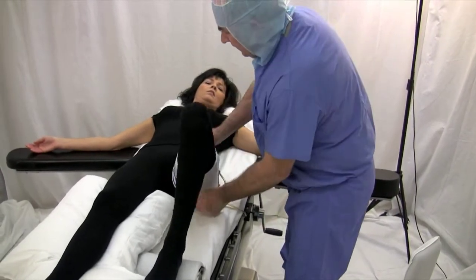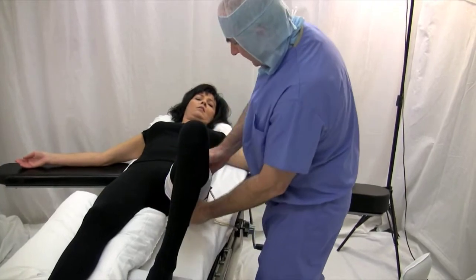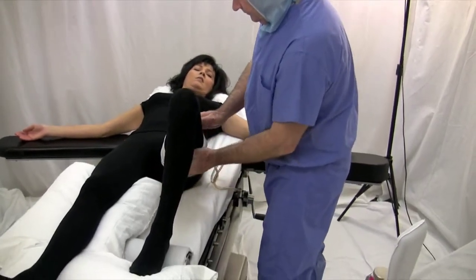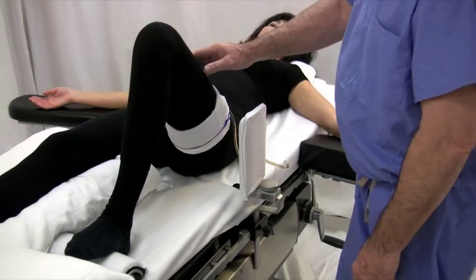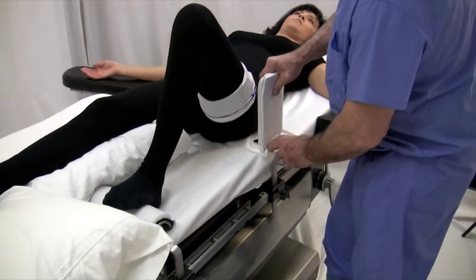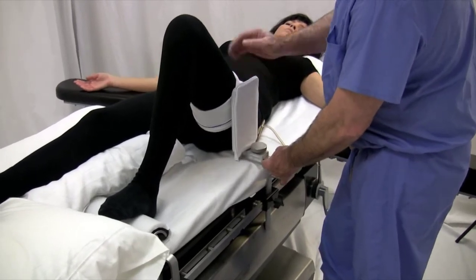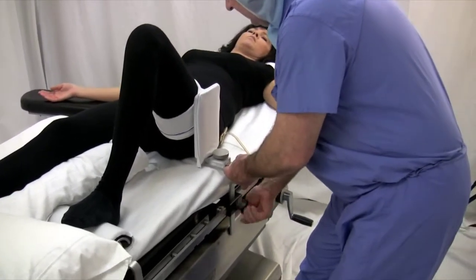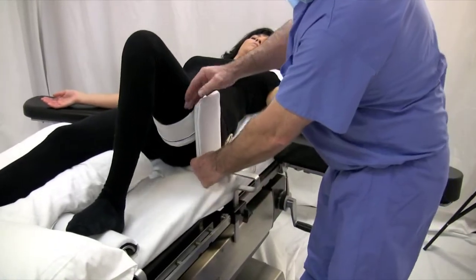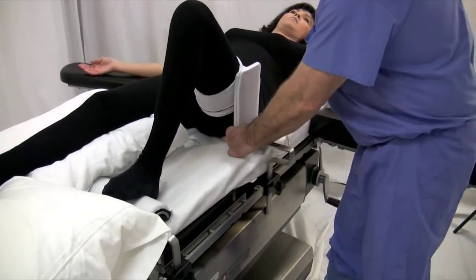Then it's rolled down in both directions, protecting the skin. Placement of the lateral support is so that it is just against the tourniquet with the knee in the flexed position, and allows space to put the isolation u-drape.